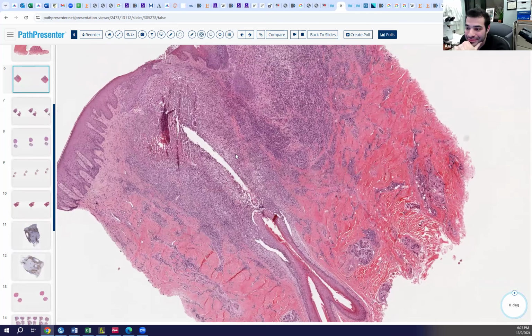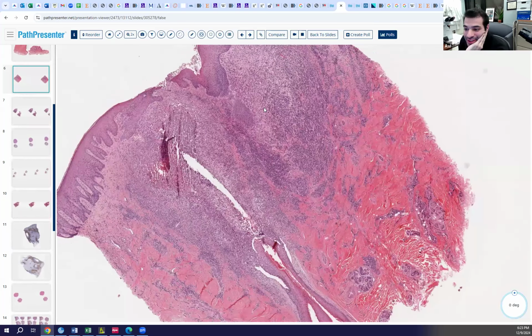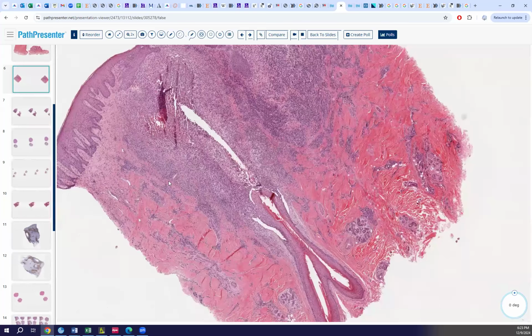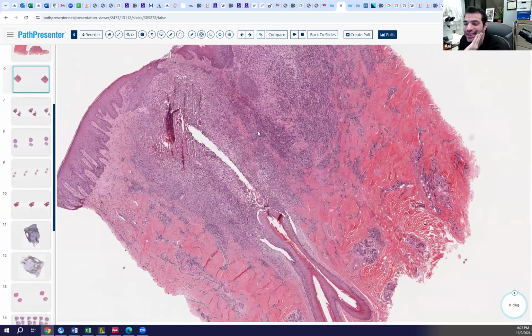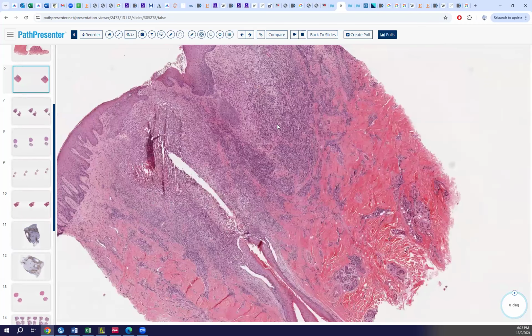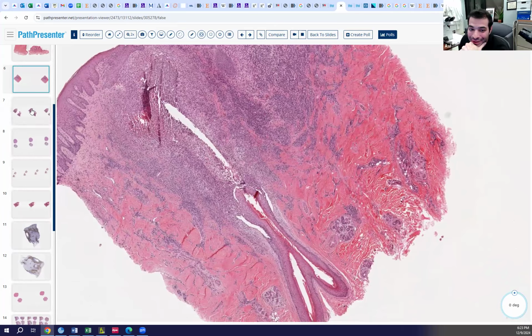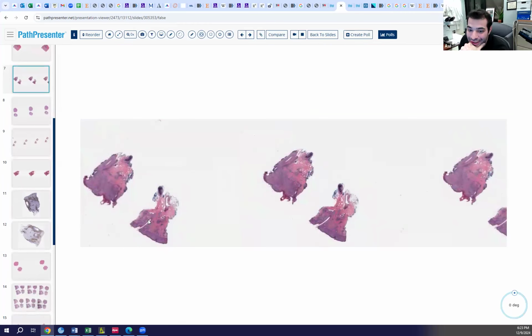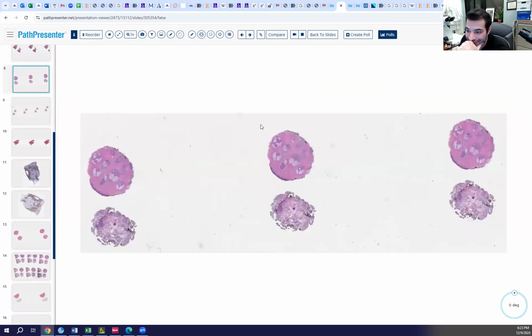What other scarring alopecias are there similar to folliculitis decalvans? Traction alopecia, depending on who you ask and what time of the day. That's not very similar to folliculitis decalvans, though. Dissecting cellulitis of the scalp. Yeah. Now this unfortunately also looks top heavy, but let's look down here.